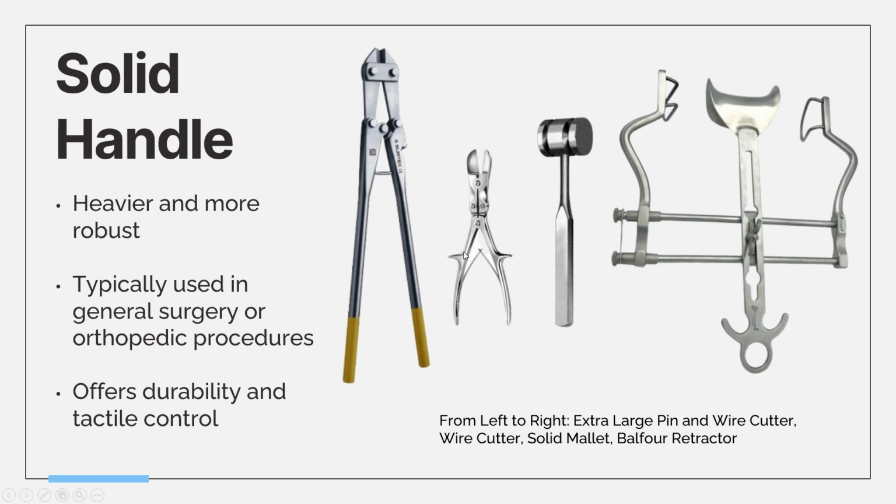The only thing about it is, even though they are heavy, this makes them more durable and actually easier to clean. And examples provided are the extra large pin and wire cutter, another wire cutter, a smaller kind, a solid mallet, and a Balfour retractor.